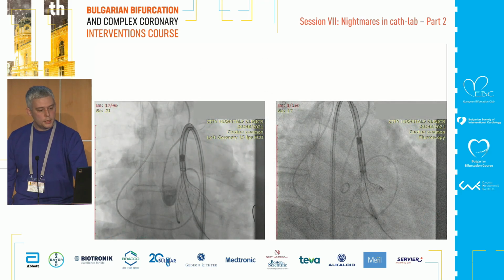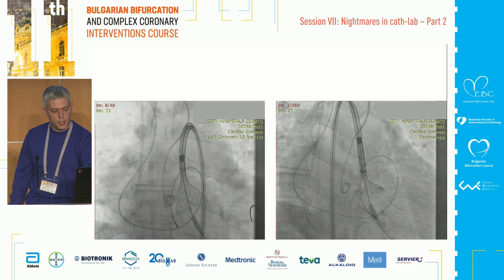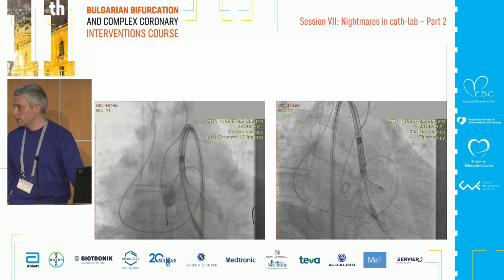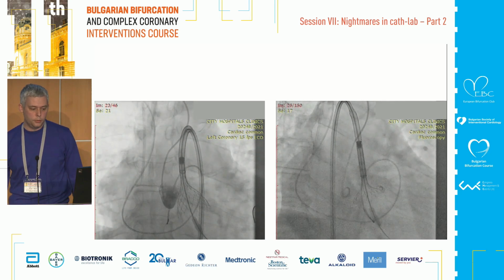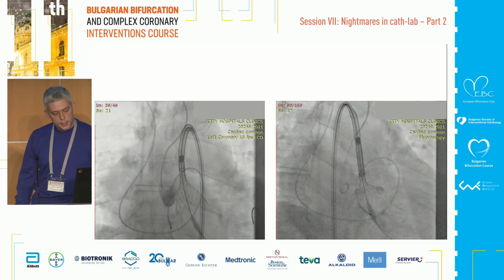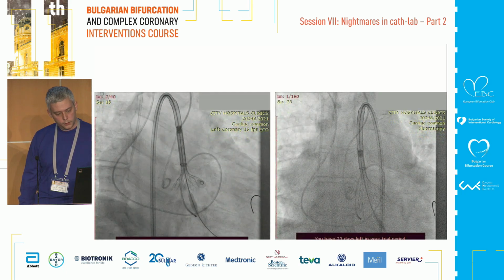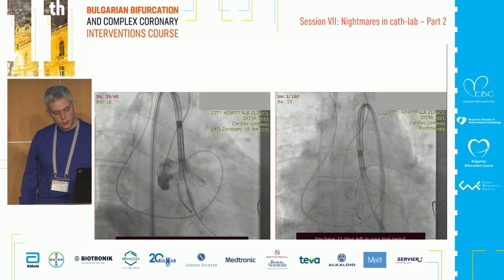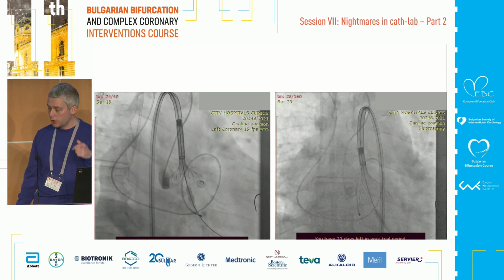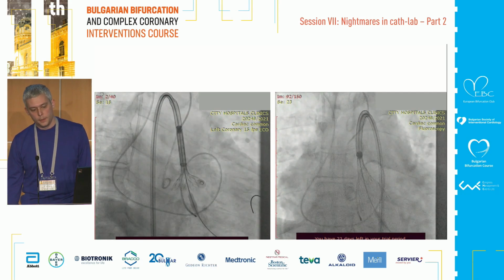And the last case is a younger patient, a 66-year-old male, who does not have a huge amount of calcium in the aortic valve or aortic annulus. Probably this made a few attempts at good positioning of the valve, here and here. As you may see, some of the positions are too deep and some are just in the aorta.